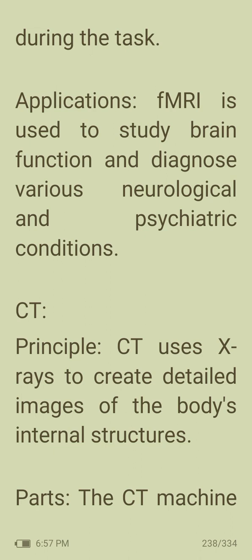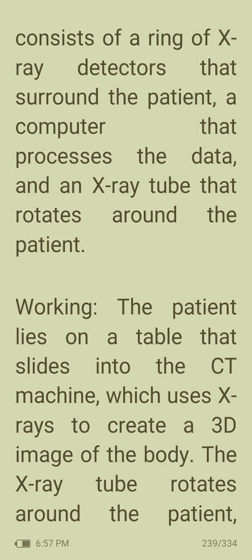Next is the CT. CT, or computed tomography, uses X-rays to create detailed images of the body's internal structures. The CT machine consists of a ring of X-ray detectors that surround the patient, a computer that processes the data, and the X-ray tube that rotates around the patient.